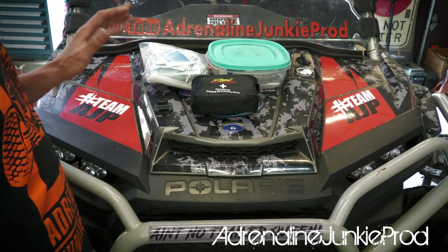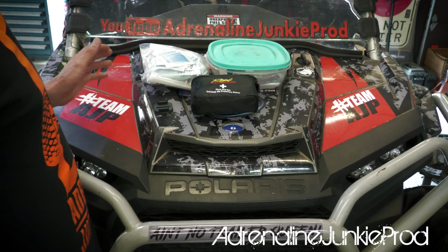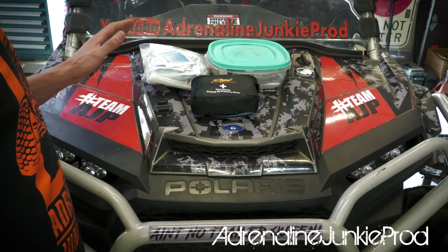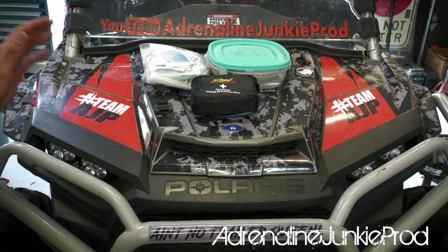Make sure it's all clean. Make sure it's sealed up so it doesn't get wet. If it does get exposed to the elements or wet, you do have to dispose of it and replace the components. You do have to go through this from time to time. I usually go through it once or twice a year, or any time I use it.